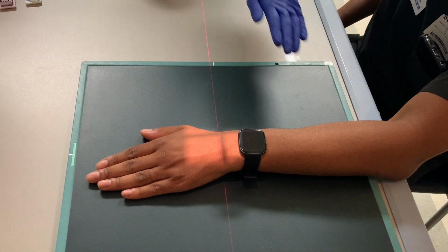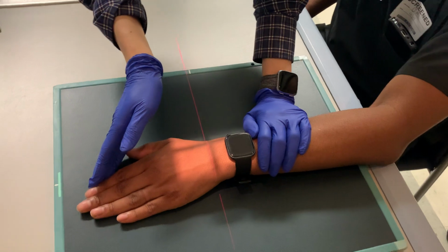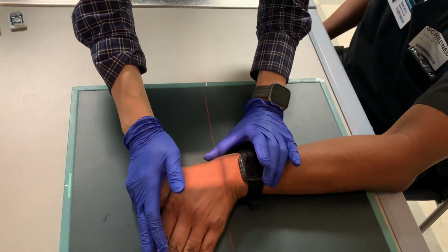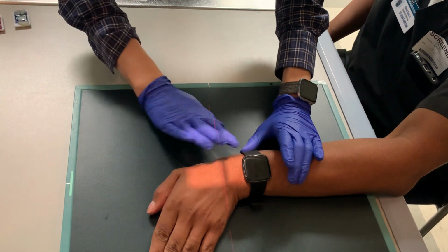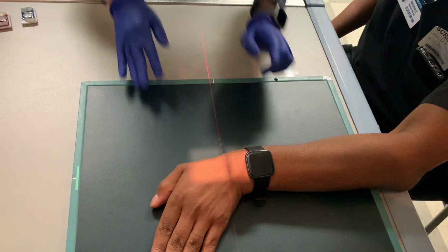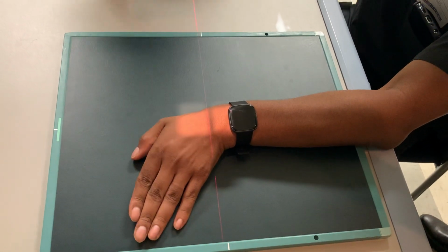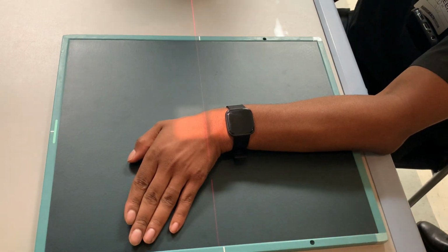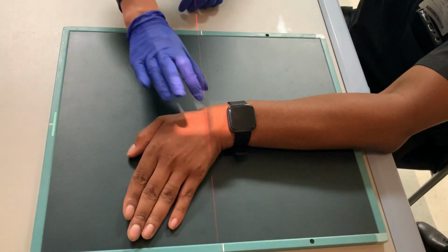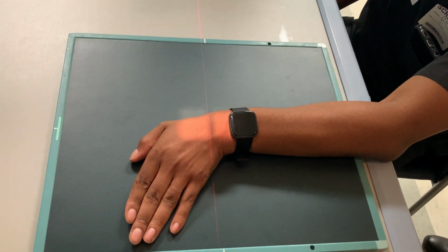Okay, so from here, I'm going to make sure that this arm stays still, and now we're going to twist as much as possible. Okay, very good. Okay, so there's that styloid. Okay, we're going to be centering there. You do not need the entire wrist. So you do not need to worry about bringing your light all the way out here. Remember, our main focus is the scaphoid, right inside there.